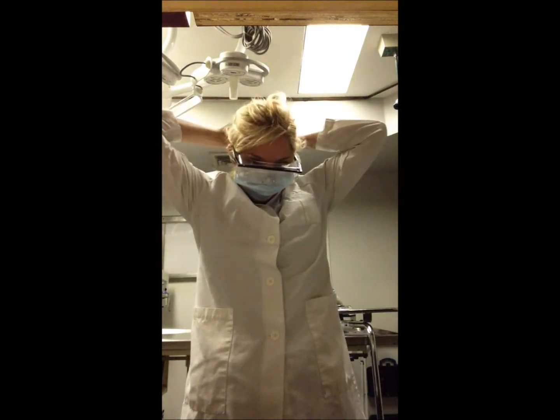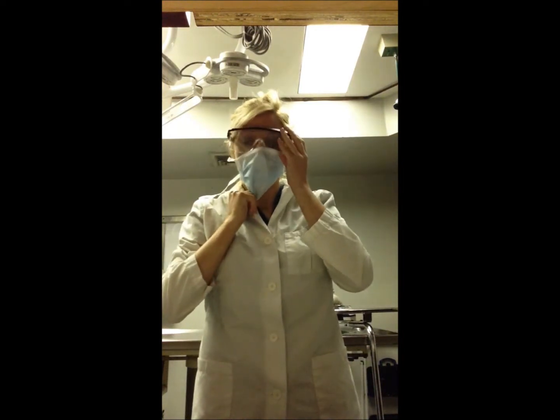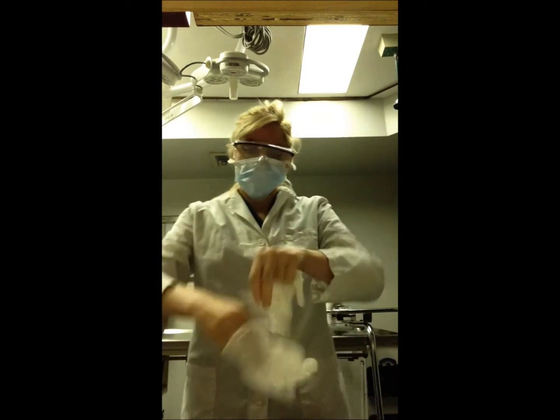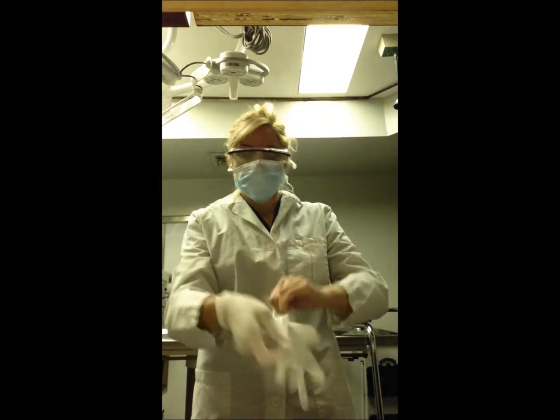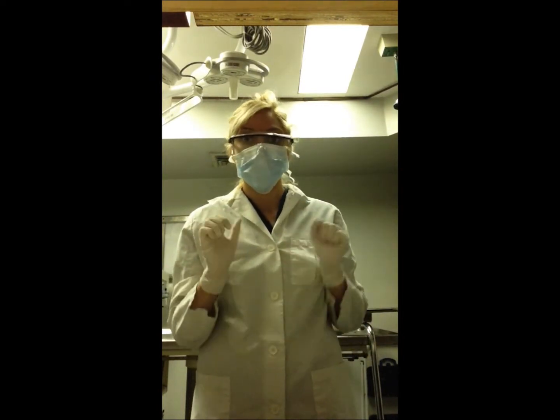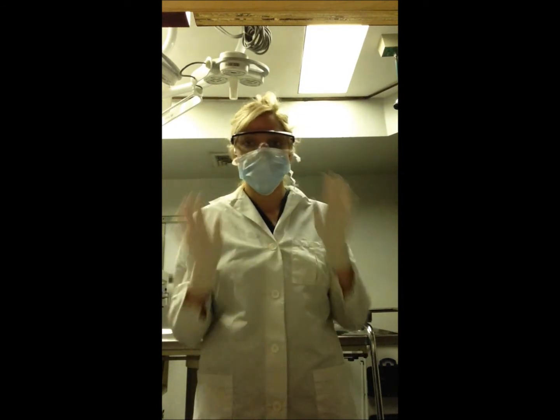And then, of course, always wear gloves when touching any patient for a necropsy, just in case they have any type of diseases, just in general for cleanliness purposes. You always want to make sure that you're properly attired for this kind of procedure.